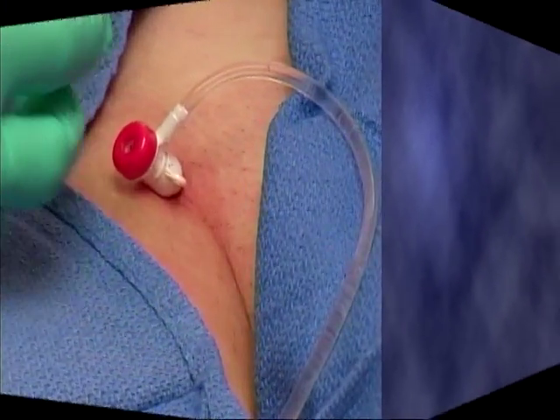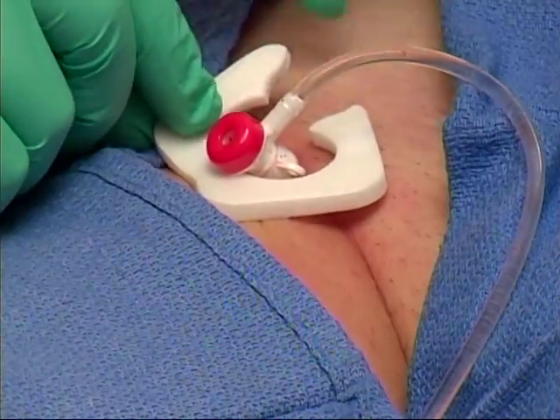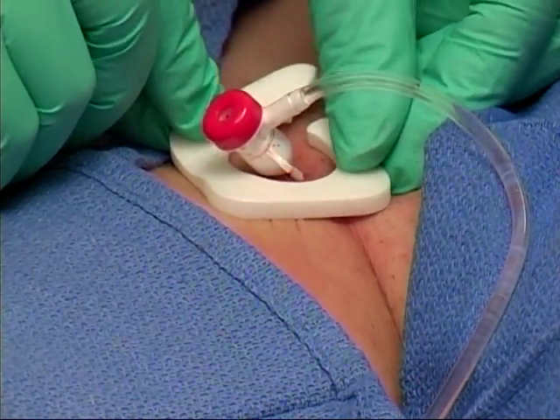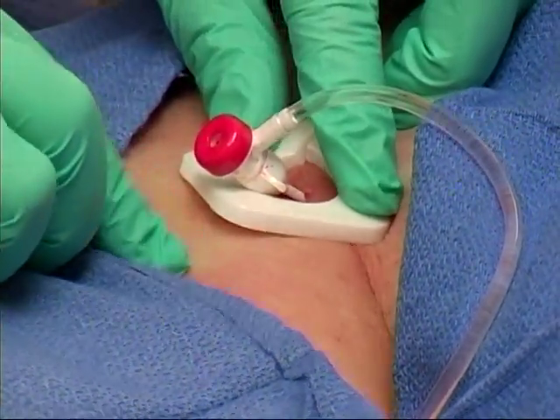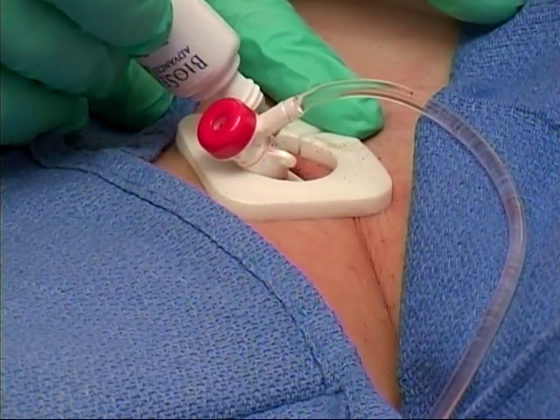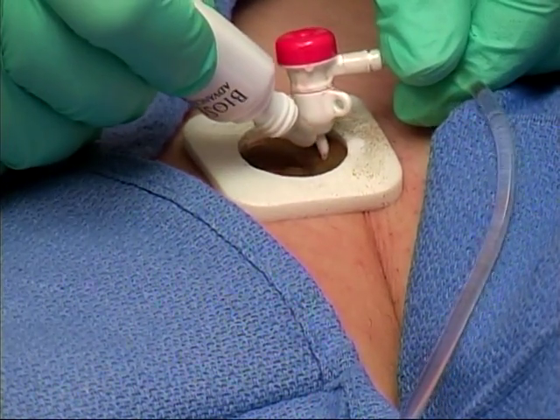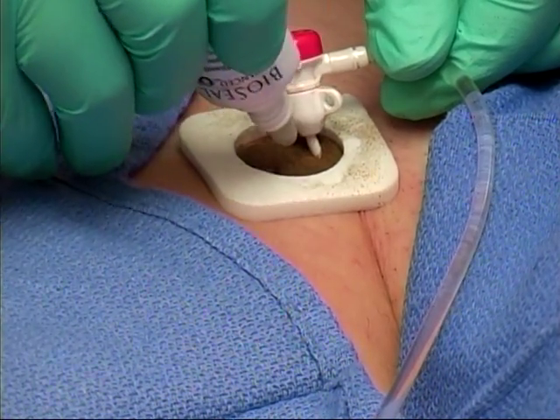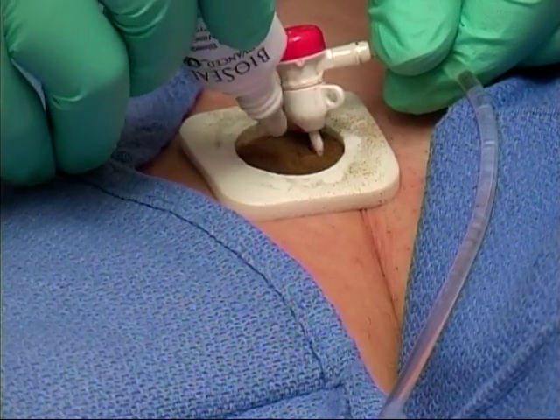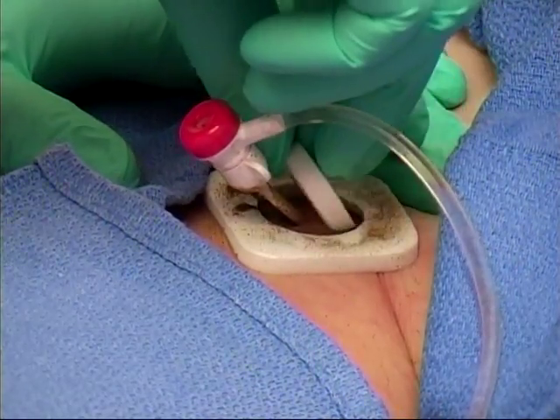Open the package and remove the PCD, or powder containment device. Remove the paper backing and center the PCD around the sheath with the slit toward the patient's head. Pour the powder into the PCD to create a pile of powder around the sheath and completely fill the PCD. Lift the sheath gently to ensure that the powder gets under the sheath. Place the foam insert over the powder.